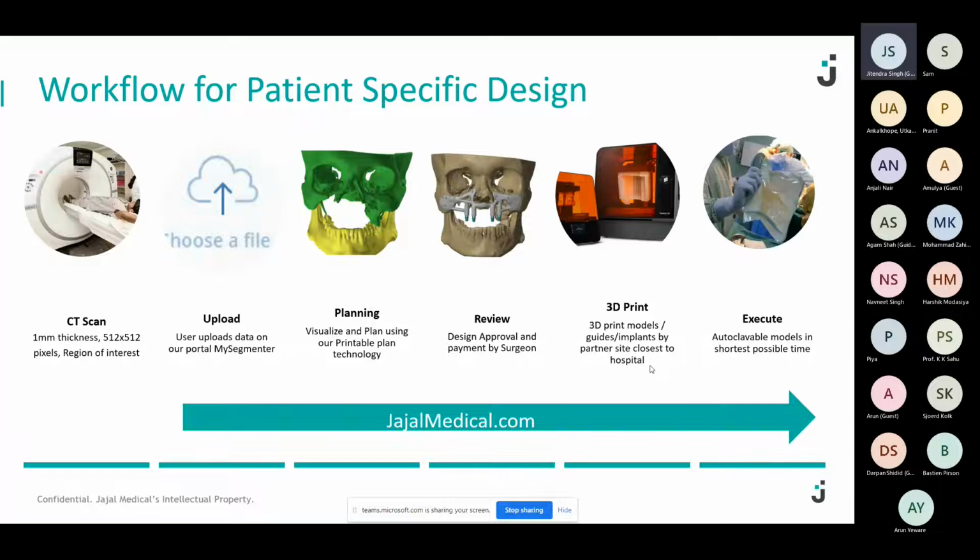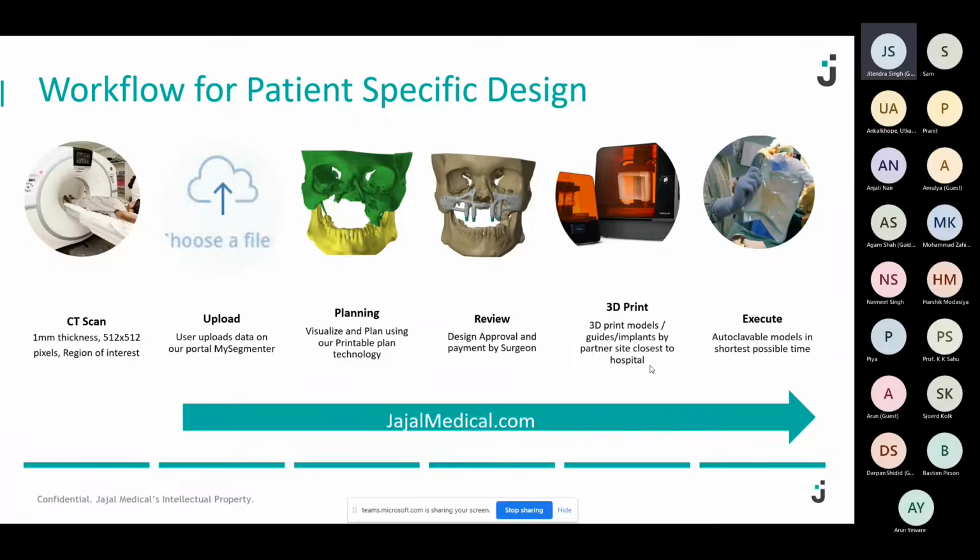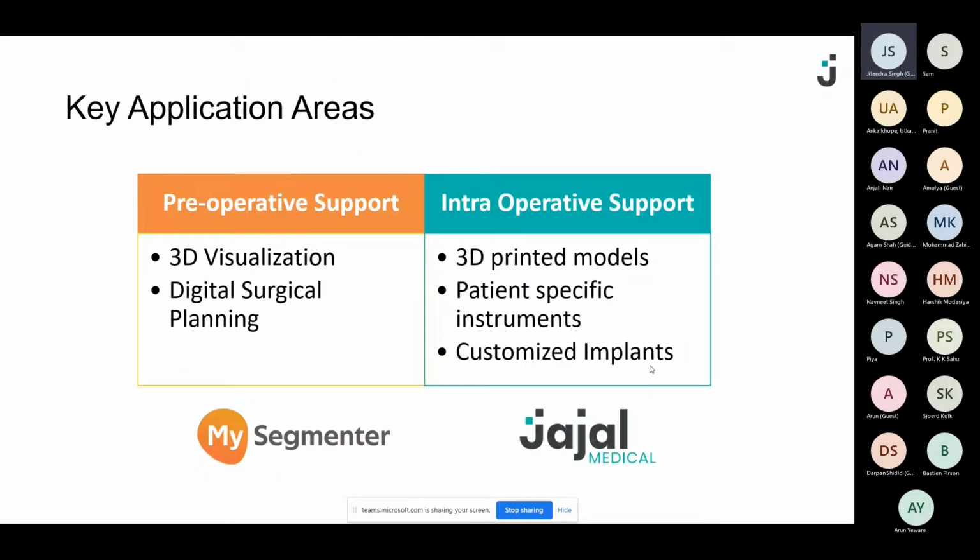Now, the reason why I'm emphasizing this patient-specific workflow is that when we break down these stages into two or three crucial areas, we realize there's quite a lot to optimize in the whole workflow, so as to get a more effective production or process flow of such customized device design and manufacturing. So, when we look at these application areas, pre-operative support, 3D visualization, and digital surgical planning, I'm going to skip this.